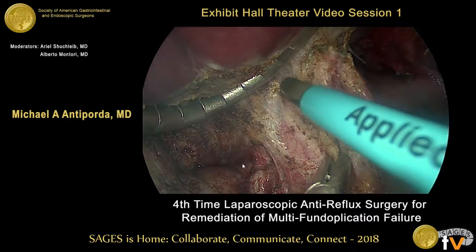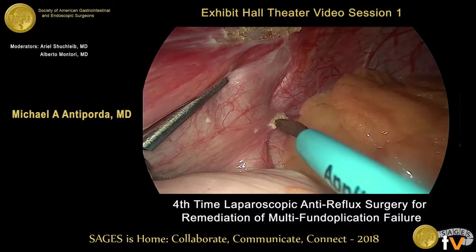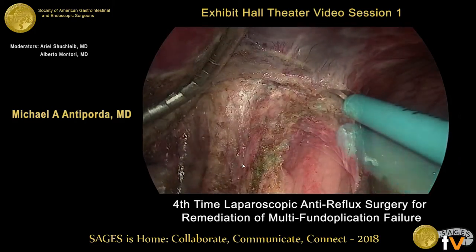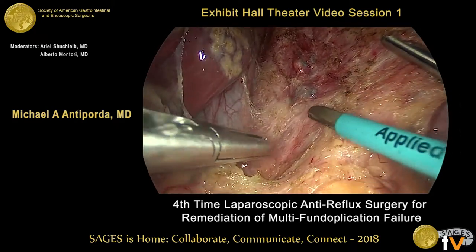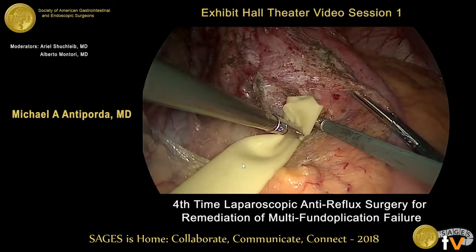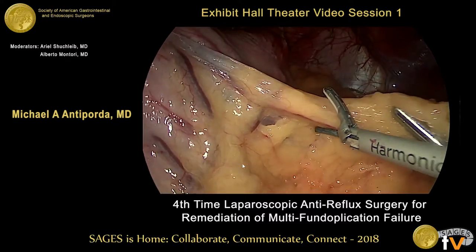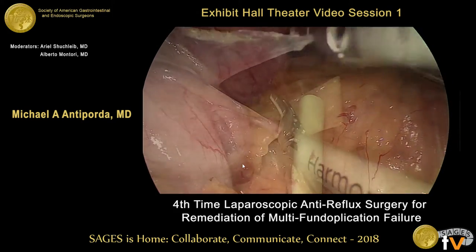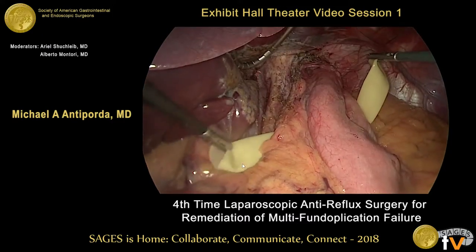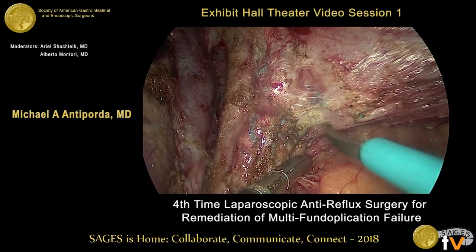The operation commences with lysis of adhesions of the stomach to the underside of the left lobe of the liver. Adhesions to the left crus are taken down and the mediastinum entered. Next, we make a window at the base of the left crus. We pass a Penrose, which will be used later to encircle the hiatal contents. The fundus is completely mobilized with transection of any remaining short gastric or posterior gastric vessels, and the posterior peritoneal fold is dissected.